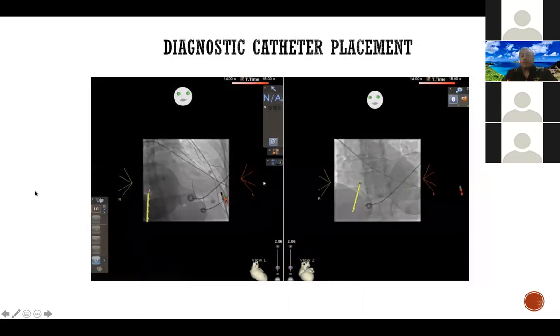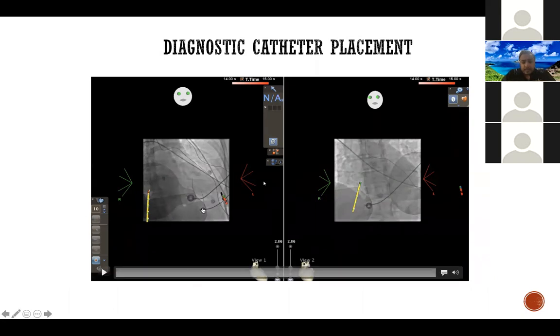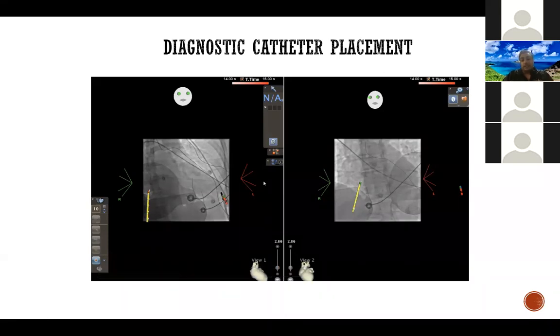So the next step was, okay, how do we get from there to, let's say you're doing an SVT study, you don't want to necessarily break out an ablation catheter, but if you don't want to use fluoro, how are you going to place your catheters? Well, at least in our lab, what we decided to do is I use a DecaNav, which is a multi-electrode catheter, and basically create my geometry using the DecaNav. With CARTO, at least, you do need to have enough matrix to visualize catheters that are going to be using impedance primarily for visualization. So it is important to get a pretty adequate matrix. And once you do that, though, it's very easy to place diagnostic catheters as well.